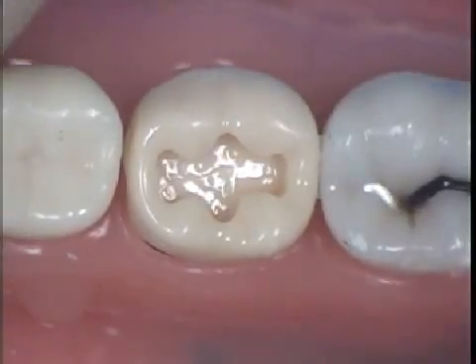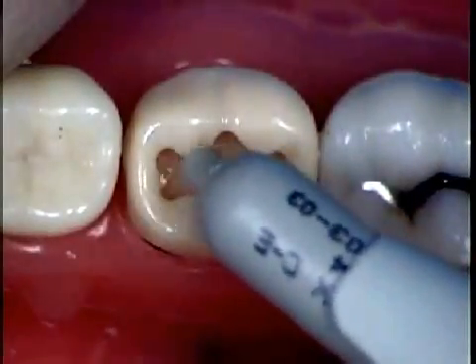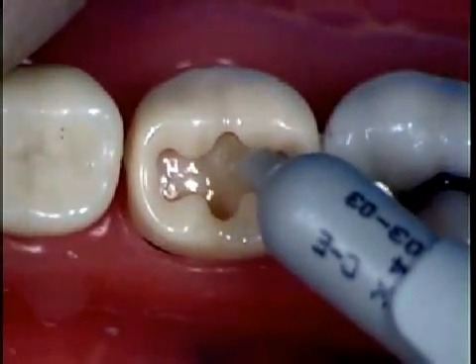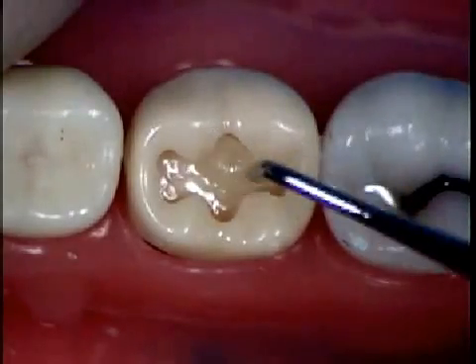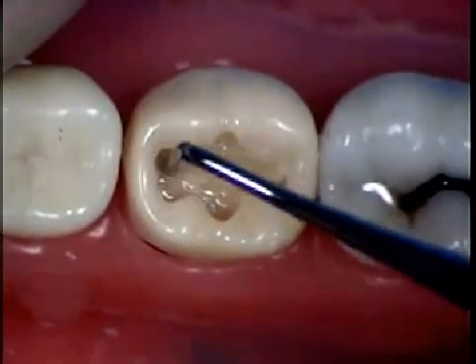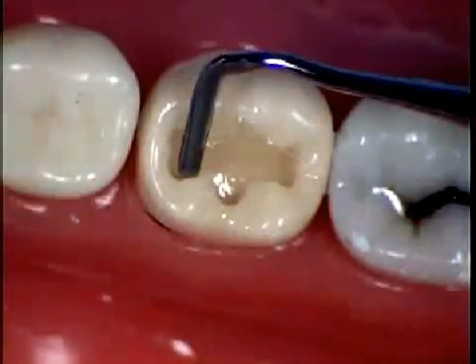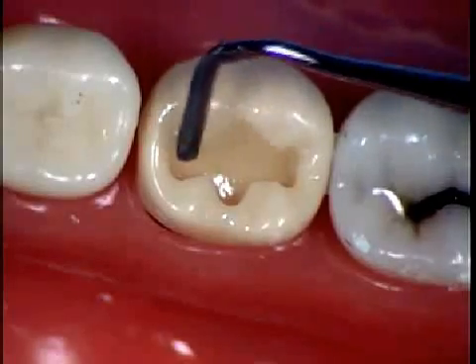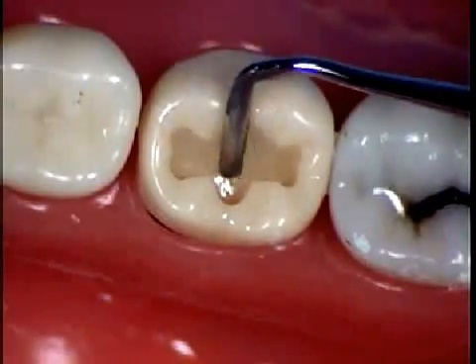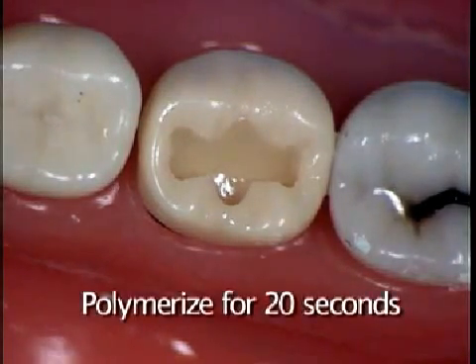For the application of the composite resin, you want to use the deep fissure design, which means that you are going to apply the composite at the buccal first, and adapt this composite with a spatula forcing against the buccal wall. You may use any spatula to apply this composite. What is important is to get a good adaptation of the material into one of the walls. After this application of the composite, you want to polymerize this layer for 20 seconds.